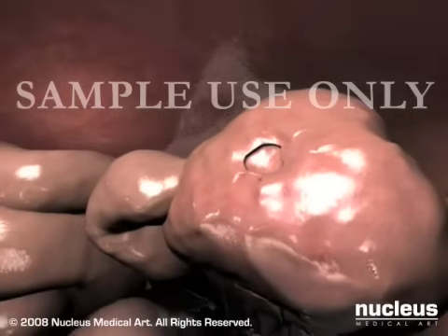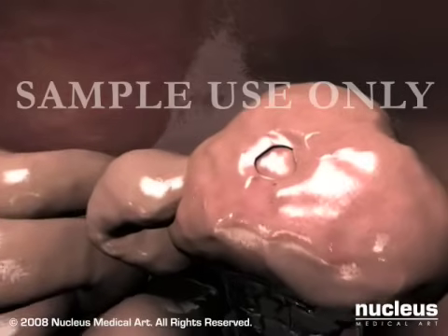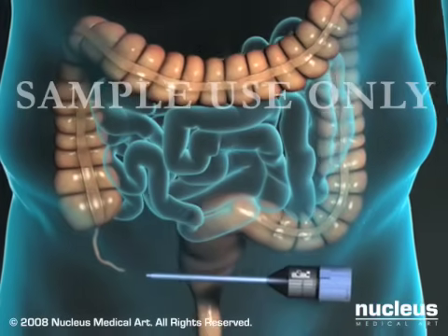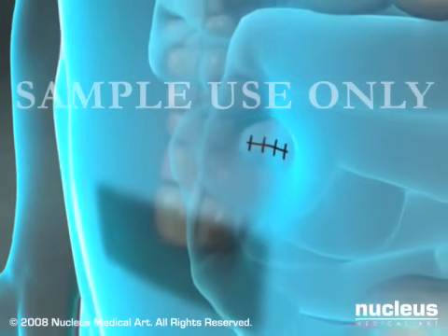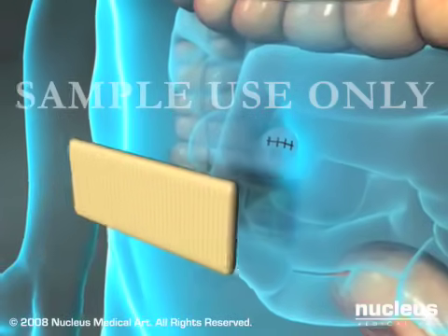Before removing the laparoscope, your surgeon will take one final look around for areas of bleeding or other damage. When the laparoscope is removed, a port valve is left in place briefly to allow all the carbon dioxide to escape from the abdomen. Finally, the keyhole incisions are closed with sutures or staples and covered with bandages.